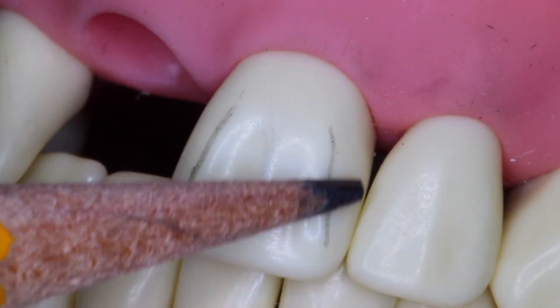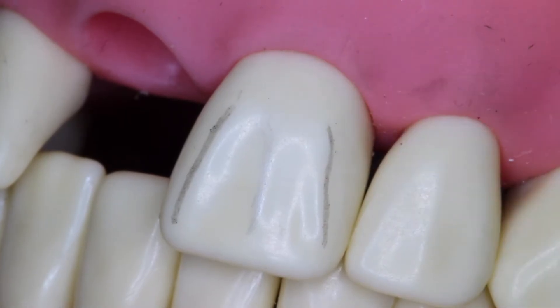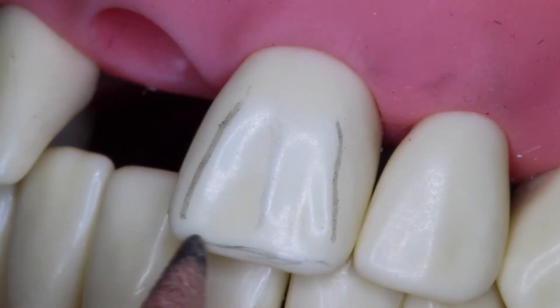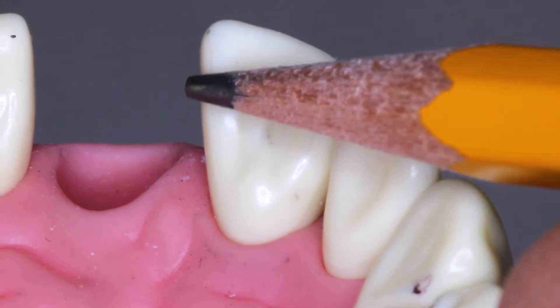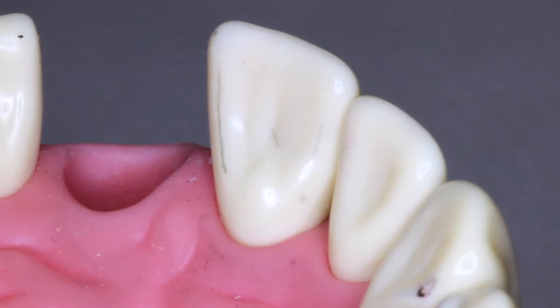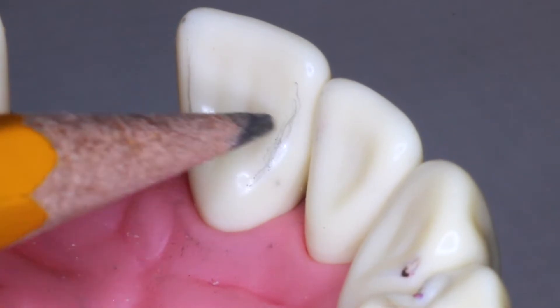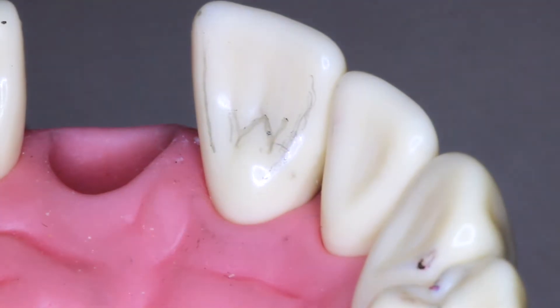The first thing you want to do on a wax up is outline your height of contours and your line angles. This will help you when you get to a monocolor wax up — it will help you see the angles. Notice the incisal edge also. We also do this on the lingual aspect because you will get to the lingual shortly and it will help you shape your tooth. Notice the cingulum, a new aspect in wax ups for you.